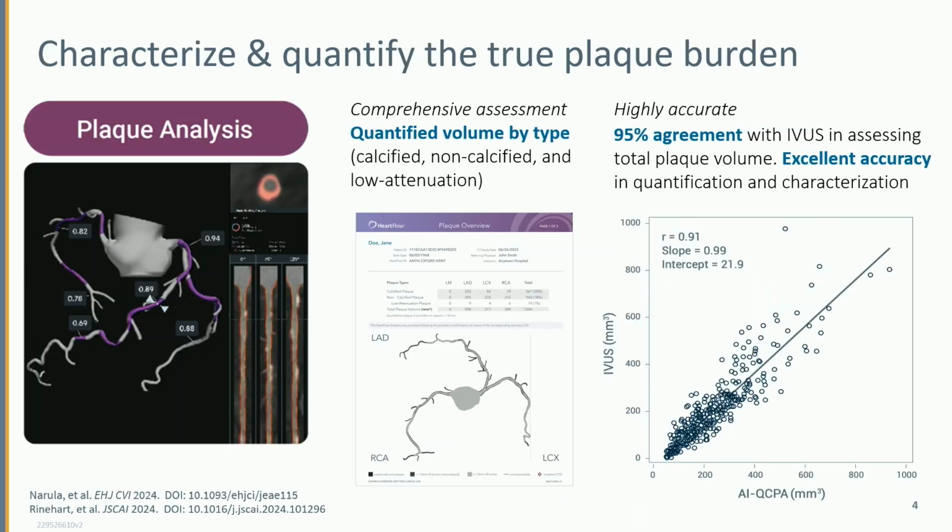So plaque analysis, what can I say? I've done a lot of work on this, not a lot of it published, you know, for grants and things like that, where you compare some quantitative assessment with some kind of invasive measure, in this case, intravascular ultrasound. There's a paper published just recently in European Heart Journal Cardiovascular Imaging, which looked at comparing plaque analysis volumetric measurements with IVUS measurements. What's critical about this slide, even though I didn't make it up, and I'm going to tell Jonathan he really screwed up with this slide, is that we have seen in the literature published data showing total volumes of plaque on IVUS are very highly correlated with total volumes of plaque on CT. What this paper showed is a very, very high correlation with non-calcified plaque. That's our big target, right, for treatment.